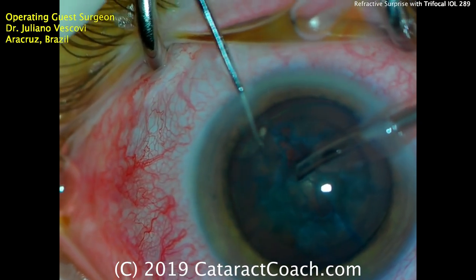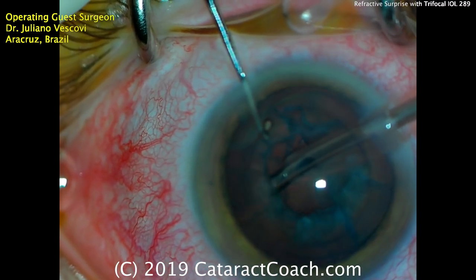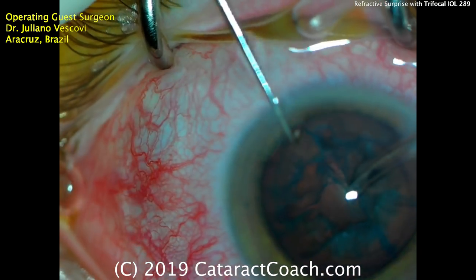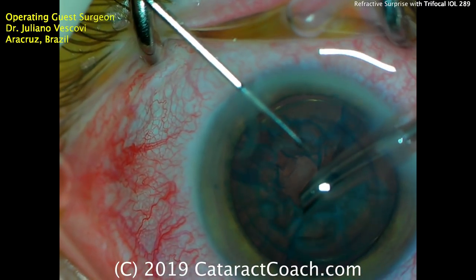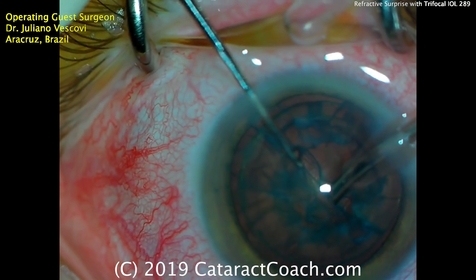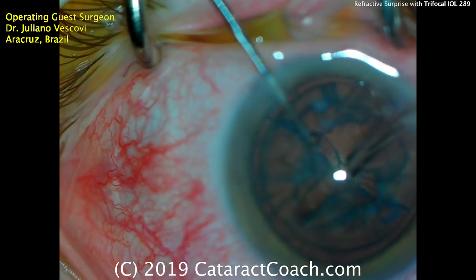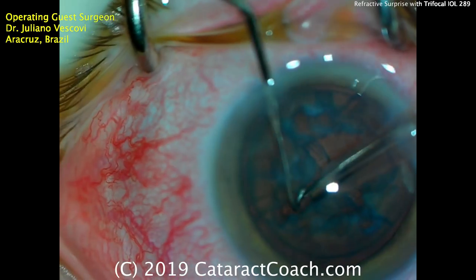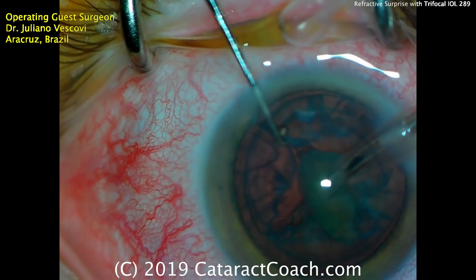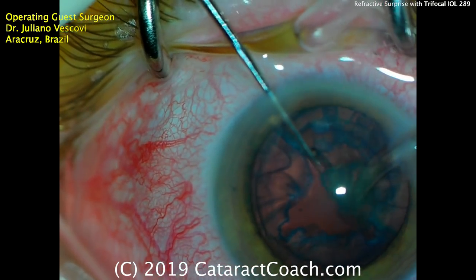Rotating the nucleus a little bit, cleaning up some cortex to improve the view, and a little vacuum to hold the piece and bring it up. It looks like grooving to split into two halves, then bringing up each half with higher vacuum and higher flow. This is not a very dense lens, so you have to be careful not to go through the nuclear half and hit the capsular bag. It looks like we're trenching another one — more like a divide and conquer — splitting it beautifully. Going back to higher vacuum, the first quadrant can be pulled out of the capsular bag quite nicely and aspirated quickly. The second piece comes out as well.